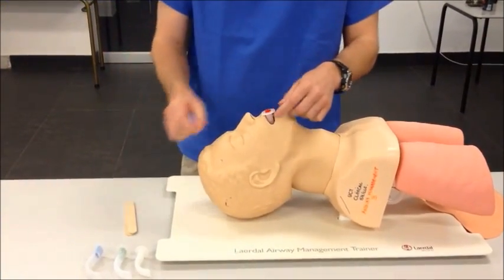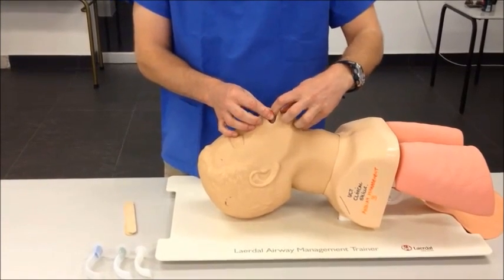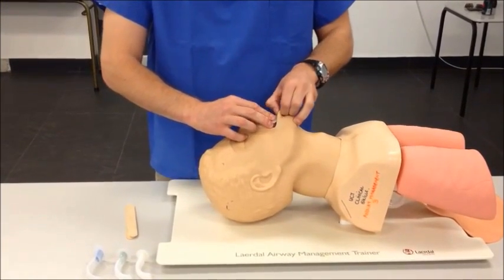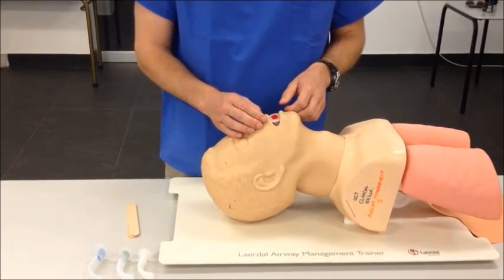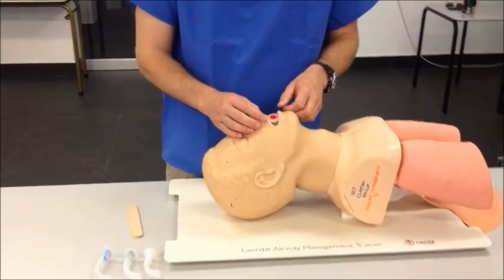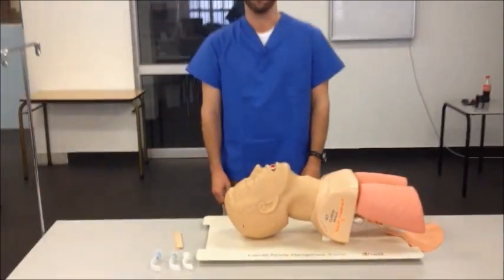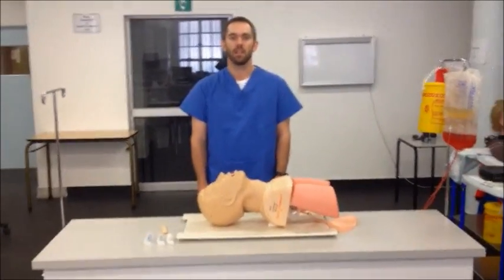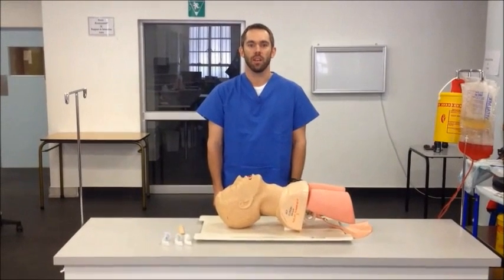The flange of the OP airway should be seated between the teeth and the lips, and care should be taken that the OP airway does not migrate into the mouth. And that's it — correct insertion and selection of an oropharyngeal airway.